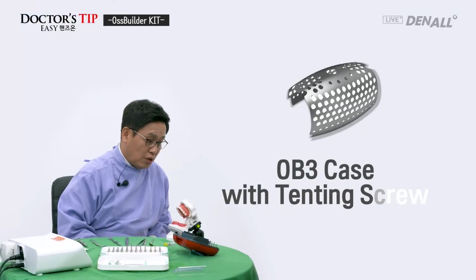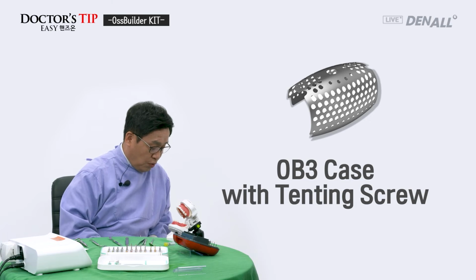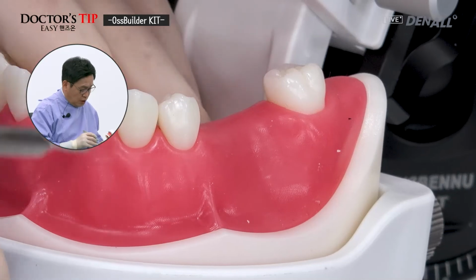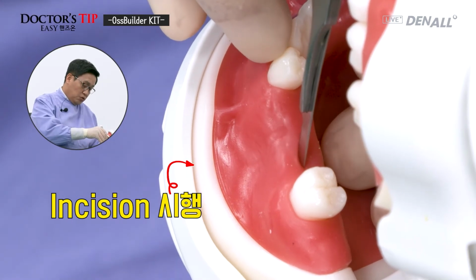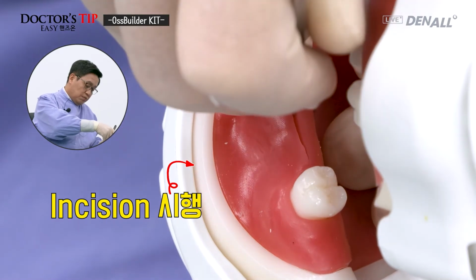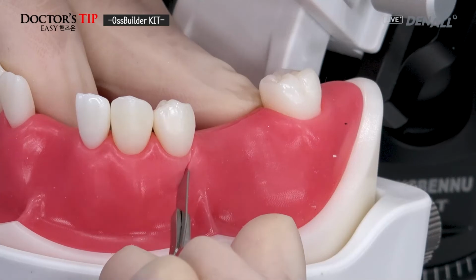Next, I'm going to use a tenting screw and OssBuilder 3 and do GBR. On the lower posterior region, there's a defect. I'm going to do an incision. I'm going to make an incision slightly more lingual than crestal and do a subcrestal incision. Next, I'm going to do a vertical releasing incision.